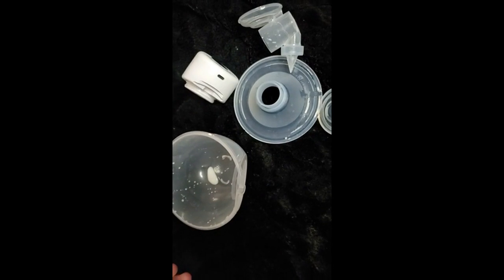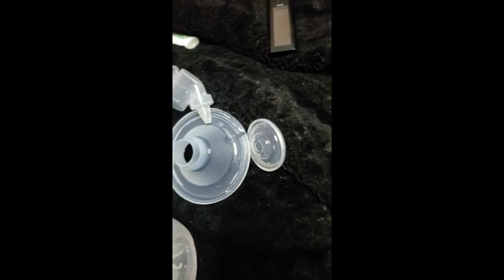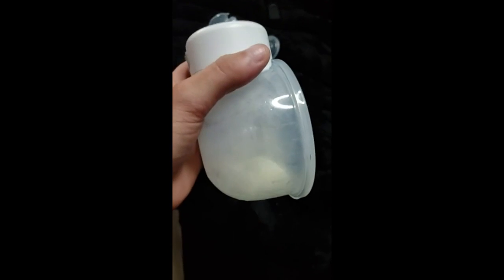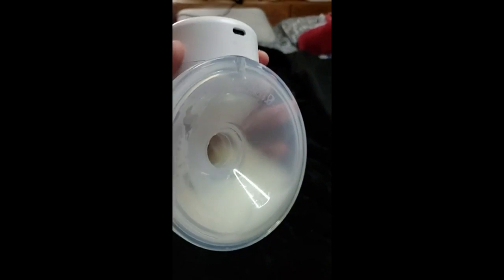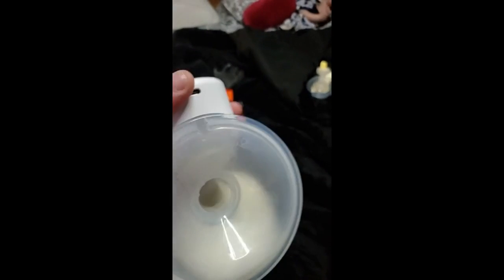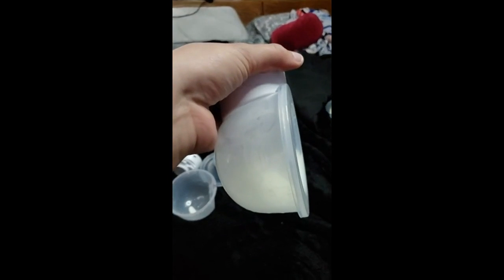So these are the pieces it comes with — I just got done using it, that's why it looks like that. You should have those pieces; I think there's four plus the battery. This is how much milk I've produced and pumped at this time.